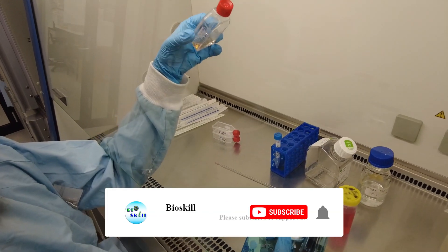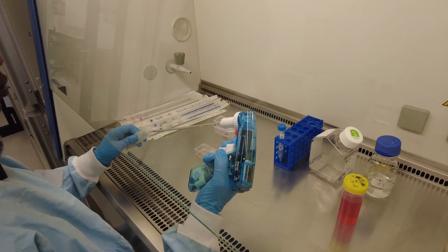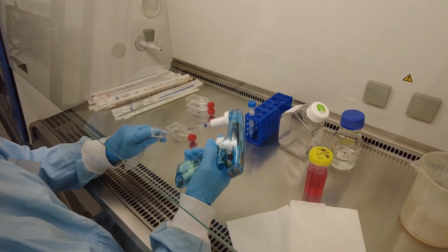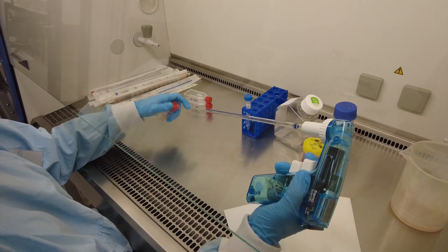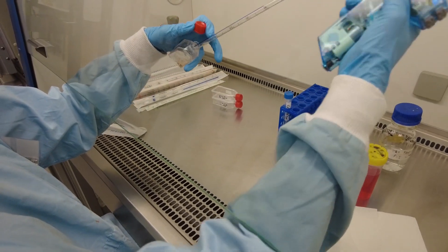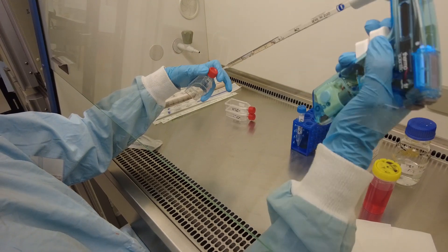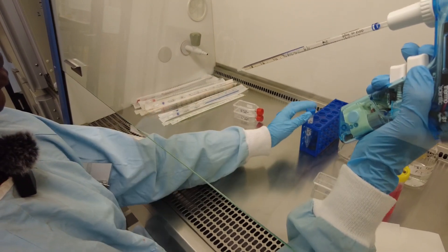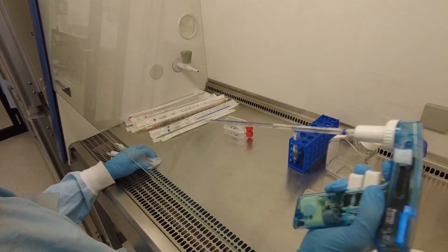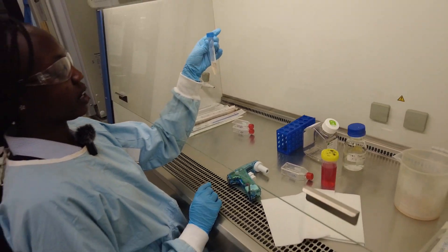So now you can see that the color has changed because there's trypsin in there. We're going to transfer this into a centrifuge tube using a five mil pipette. Make sure we get all the cells from the surface — take everything. There's about four mil in there. We're going to centrifuge this down.